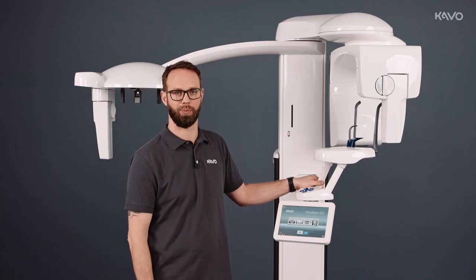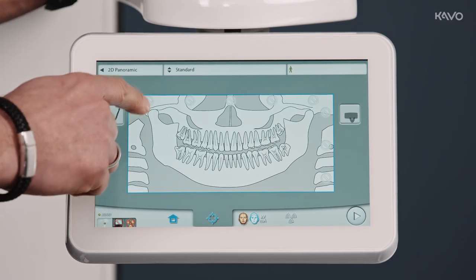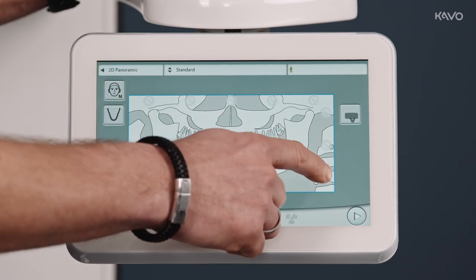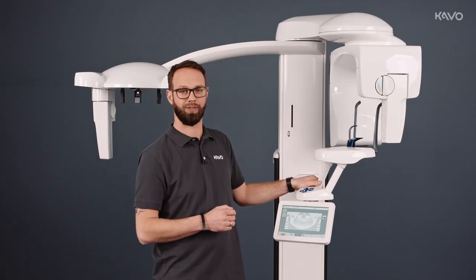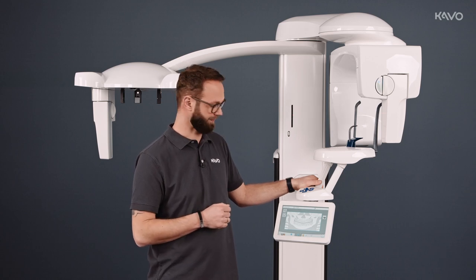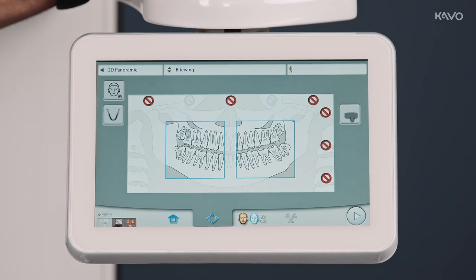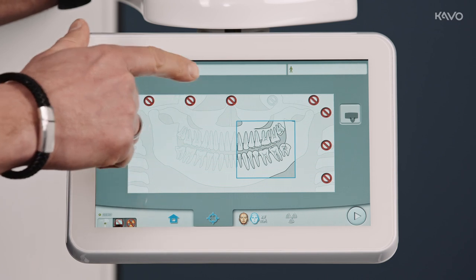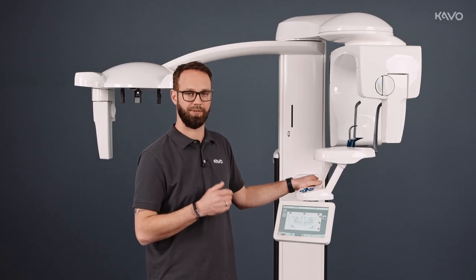After activating this in Romexis, we go to panorama on the unit, where we have the option of vertical and horizontal selection. This means that we can choose between half side, lower jaw and upper jaw imaging. We can also select bitewing imaging here. Incidentally, this is set in the same way as the panoramic image.